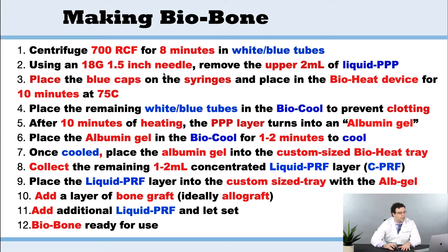We're going to use the 18 gauge needle. We're going to remove the upper two mLs. We're then going to place everything into the bioheat the same way with the blue caps, and this is going to be done for 10 minutes at 75 degrees Celsius. Once that's done, the main tubes — the blue tubes — are going to go into the biocool.